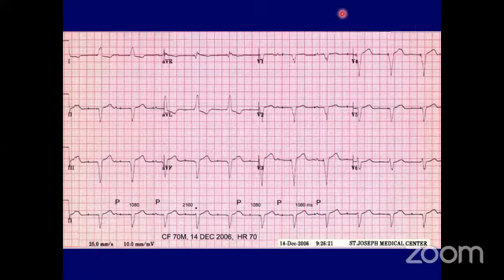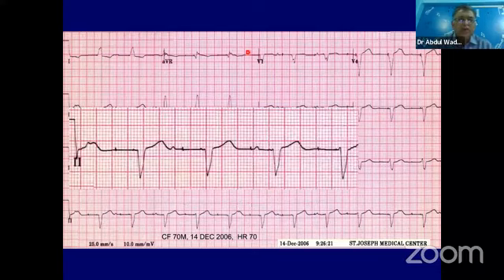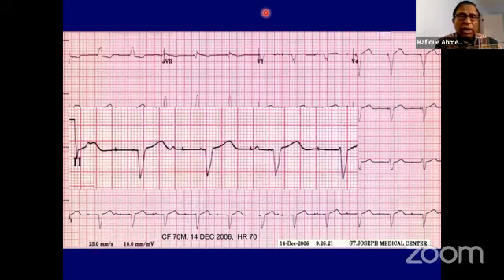Sir, I have a question. If this patient has good LV function, should he not make it VVIR? Well, the question is, how old is the patient? 70-year-old. And depending on how old this lead is, number one, if it is a newly implanted pacemaker, definitely I'm going to revise it.